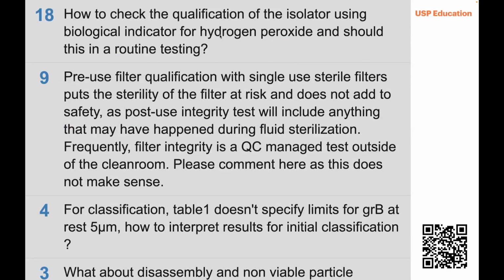I would expect, like all decontamination or sterility type tests, that an annual requalification would be appropriate, mostly to assure over time. I don't know if that is a specific requirement. It's probably good practice. It is a decontamination, a sterilization process, and things could happen over time. Gamma, we do quarterly; autoclaves, we do annually. All these different sterilization processes have requalification, so I would expect requalification would also apply here.